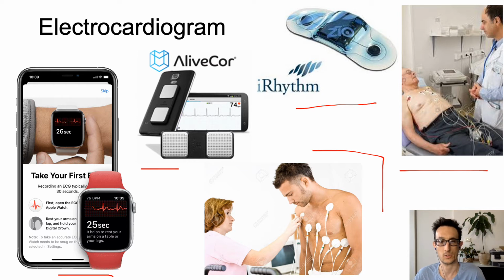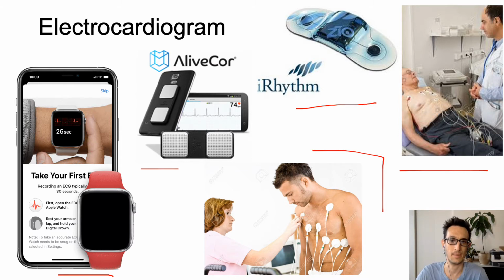So a 12-lead ECG would happen in a clinical setting. As a patient, you would typically be sitting up or laying down, and then you would have a bunch of electrodes placed on your chest as well as on your limbs, and then a recording would be taken.